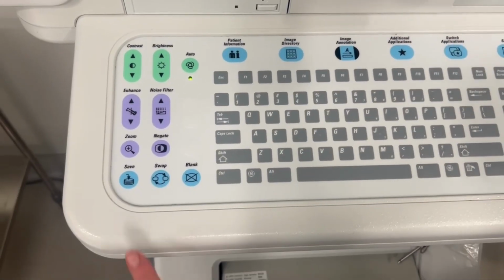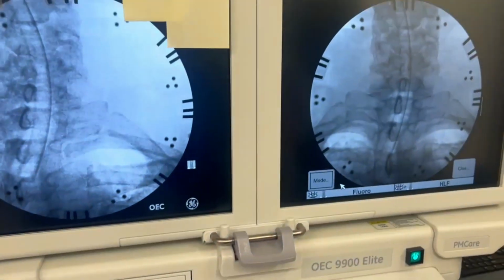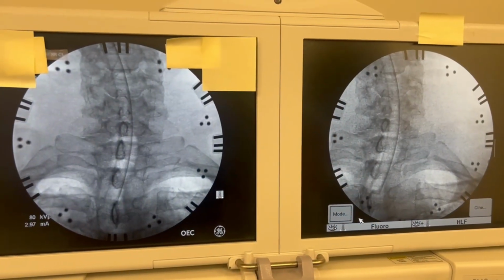The swap workstation button functions to move the left image from the monitor on the left to the monitor on the right.